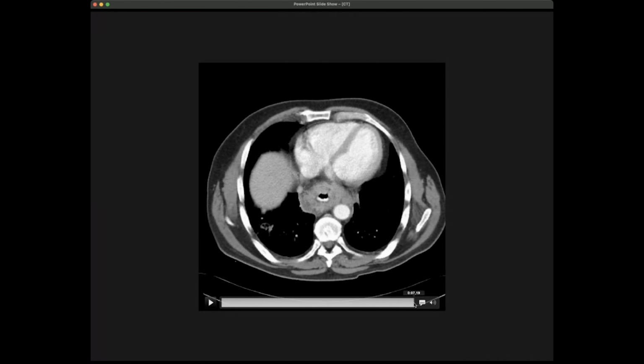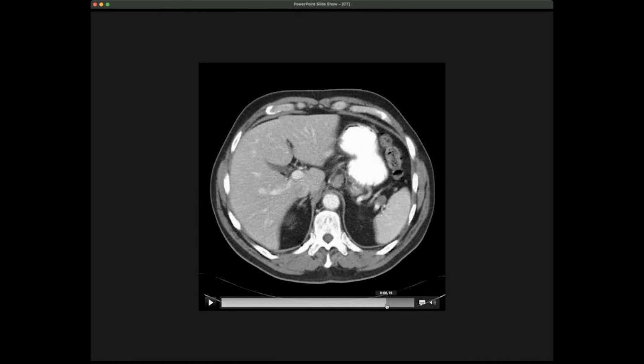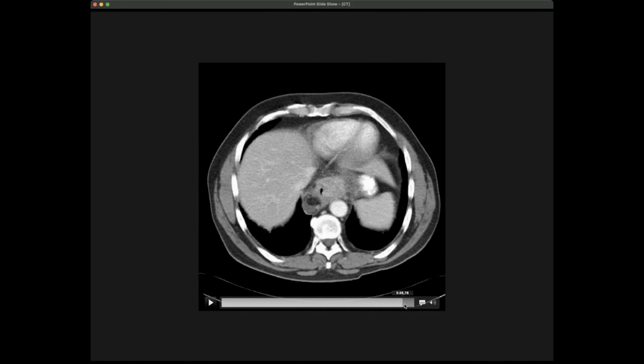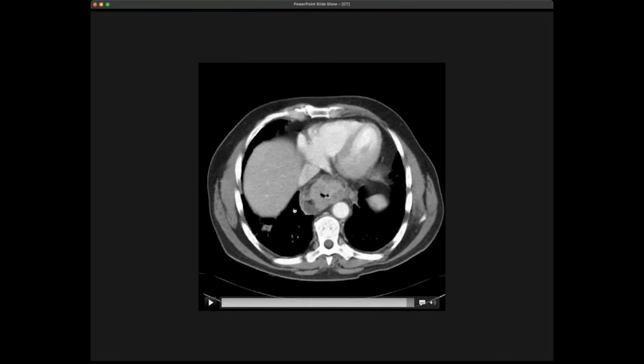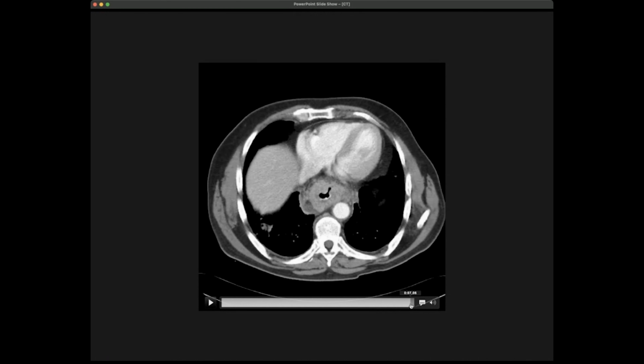And then you just go up through the liver, as I said before. Here you have a cross-section through the heart. So this is what we call an abdominal scan. And of course here, you start to see the lungs. So you go from the liver, and what you then see is that the lungs start to appear here. So these are like large fields of air. And here, this is actually the diaphragm that you go through. So this way, by looking at the gray values on our CT image, you convert that to the type of material we go through. And this way, together with the position, you can actually infer what the clinical information is.